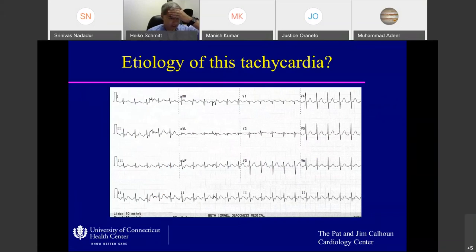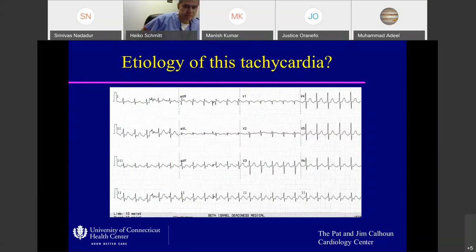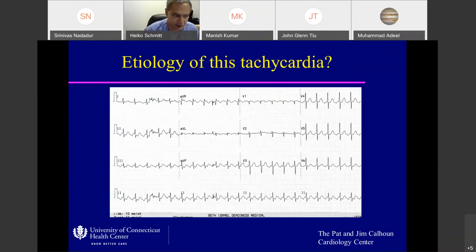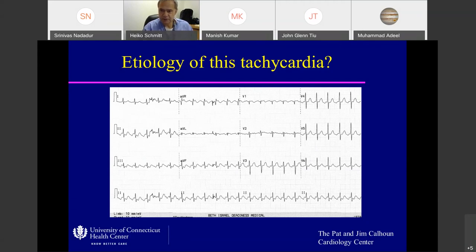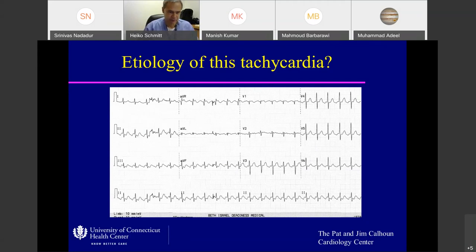Now it's your turn — what kind of tachycardia is that? One of the first-years can take this one. Manish and Mahmoud introduced themselves. Looking at the ECG, one fellow says it looks like sinus tach; another says there are multiple P waves and it looks like atrial flutter. Mahmoud says he thinks it's sinus tachycardia because he sees a P wave before every QRS complex, particularly in the long strip in lead II.